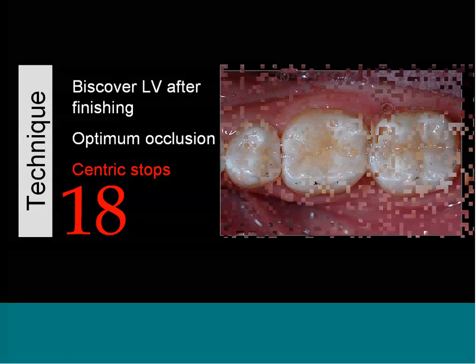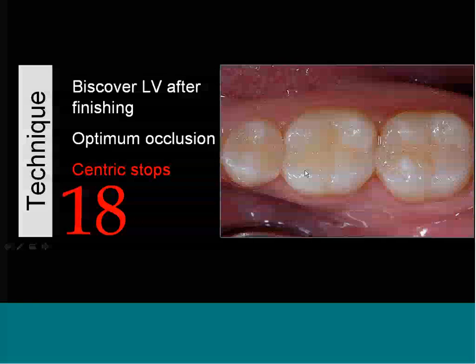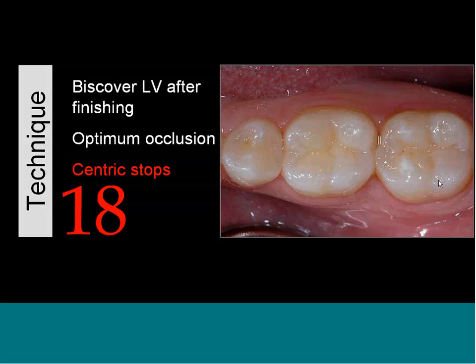And afterward, after the isolation was removed, we use Biscover LV to seal over, because any area that's been finished, no matter how finely, still has some micro cracks in the composite. So we're going to use the Biscover to fill in those areas and seal over the restoration. And what we'd like to see, let me go back here, is when we pop off the rubber dam and have the patient bite, they're pretty close to being in centric. So we have these little marks here, the patient's pretty close, and that way we have a minimum amount of finishing afterwards.